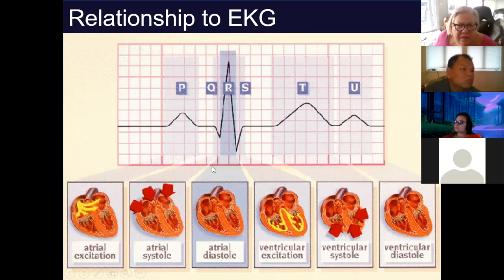Then you're starting here with the QRS, which is the big, pointy, spiky complex seen on EKGs. First, there's the Q, which is a little bit below baseline. The R wave, which in lead 2 is always upright with one point.